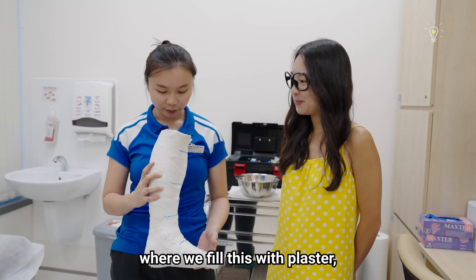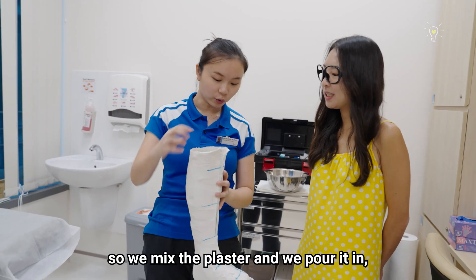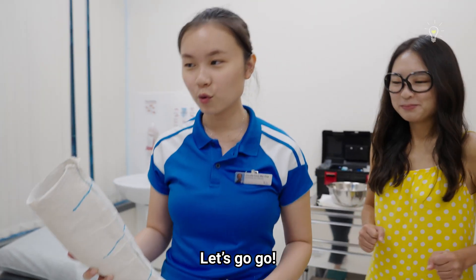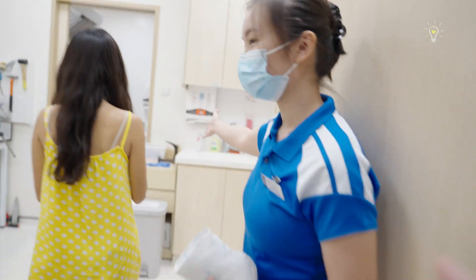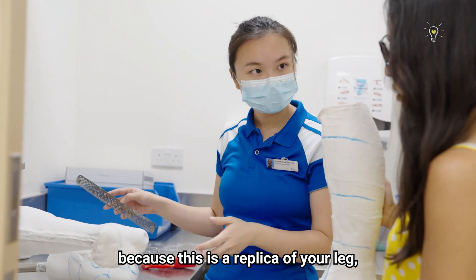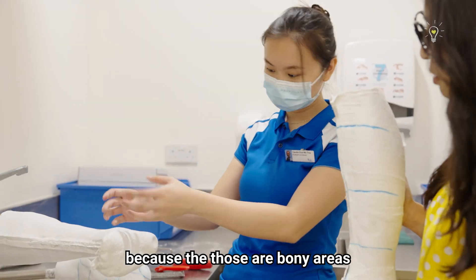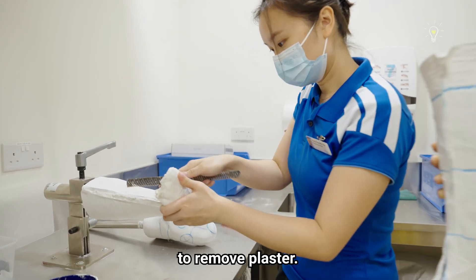We're going to move on to the next part where we fill this with plaster. So we mix the plaster, pour it in, and this becomes a replica of your leg. Modification would be to remove plaster in areas where you want it to be tight, and add plaster on bony areas like the ankle where you want to make space.